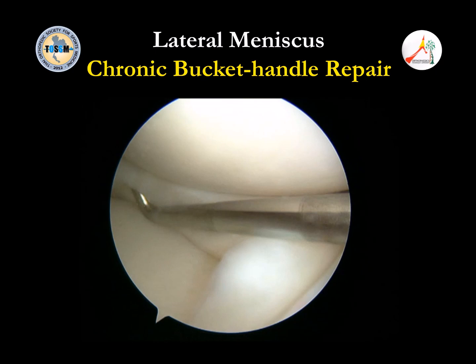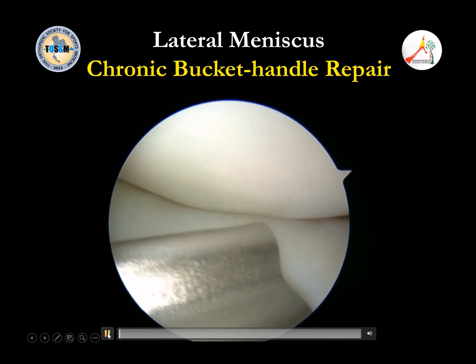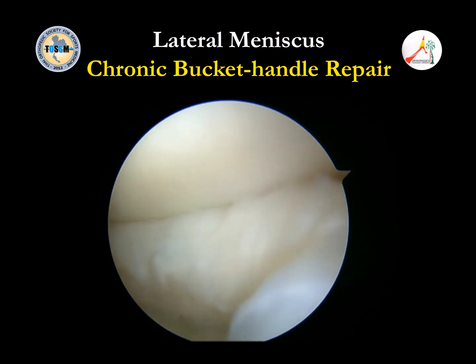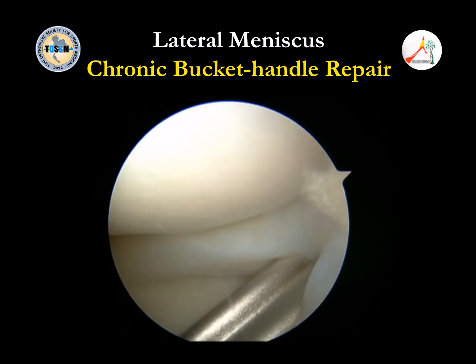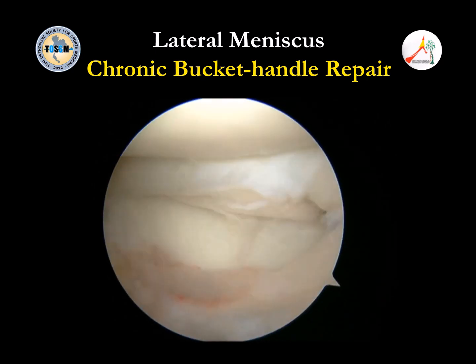So the trick is you can do this inside out. You start with inside out first because inside out helps you to reduce the meniscus. One stitch is not enough. Sometimes 2, 3, 4 stitches. You see?